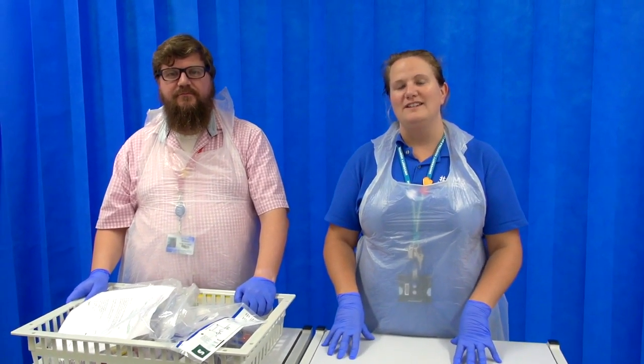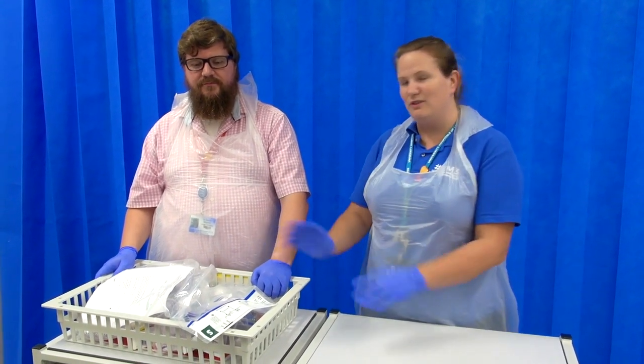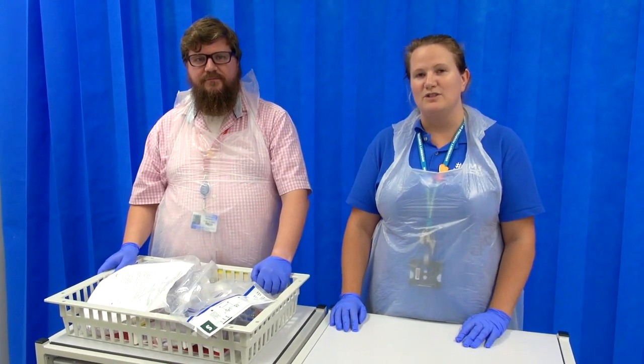Hi there. Today we're going to go through demonstrating how to attach an NIV machine to a patient. First we're going to go through the equipment and then we'll go through how to attach the machine to the patient.